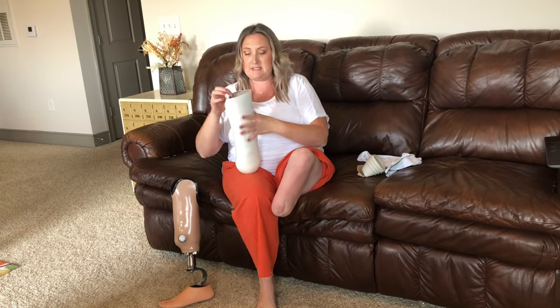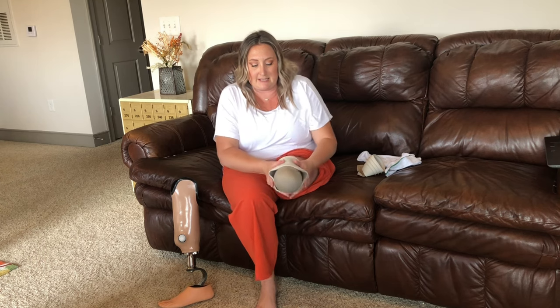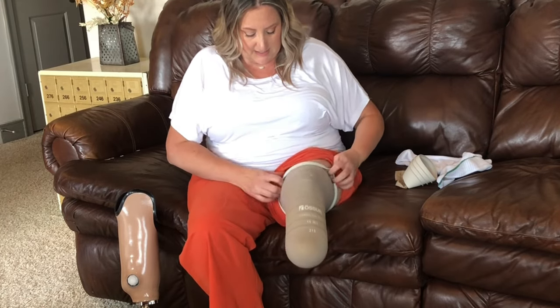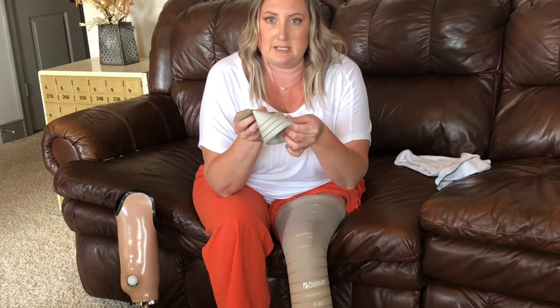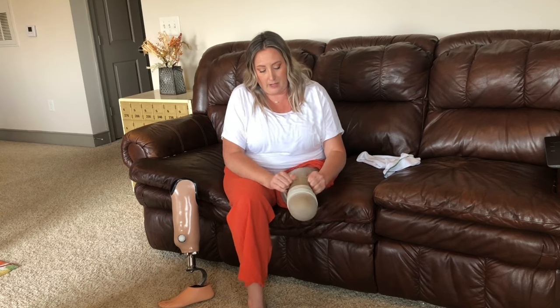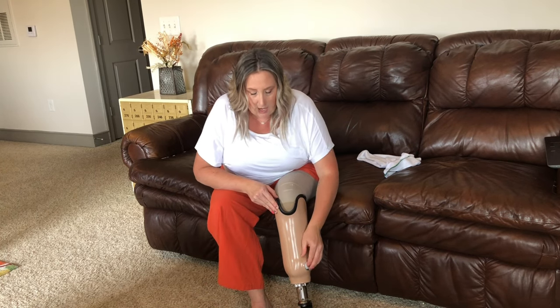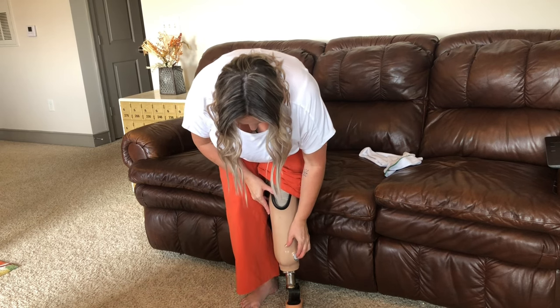The ring system is a liner that has kind of a gel consistency to protect the skin. These lines on here are silicone and they can create their own suction, but this system works best with the rings. These little rings create even more suction and really hold this socket on, so that when I put them on and push my leg in, I open the valve, then close it, and that thing is stuck on there — it's not coming off.